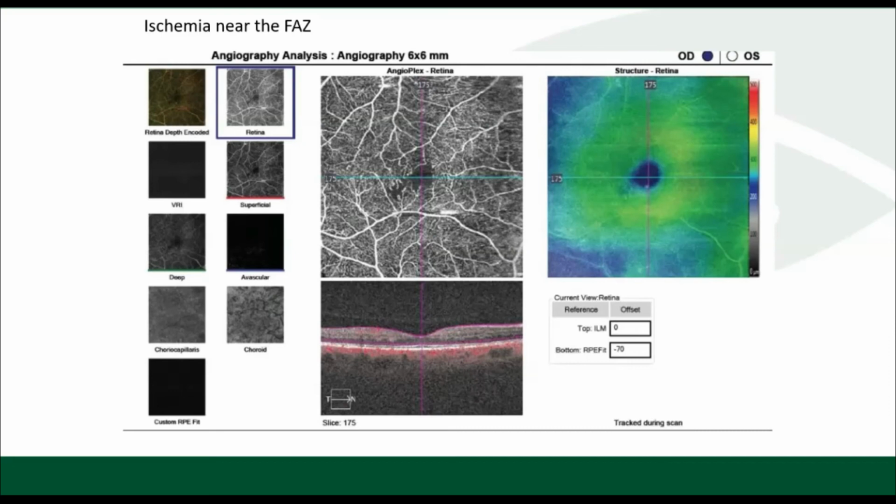Alexandra, what has been your experience, particularly in patients with diabetic retinopathy, being able to see and capture low flow or ischemia? I agree with you, Mark. I think it's been tremendous for that because I still use a lot of fluorescein angiography, obviously, because with the current technology in OCT-A, we can't quite go out as far as wide field fluorescein angiography is capable of doing.